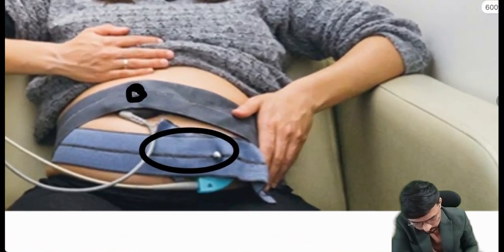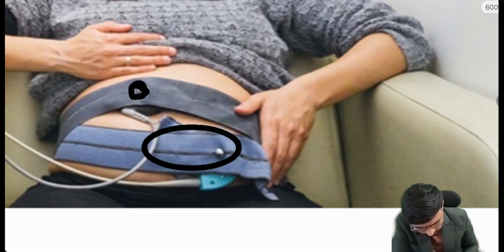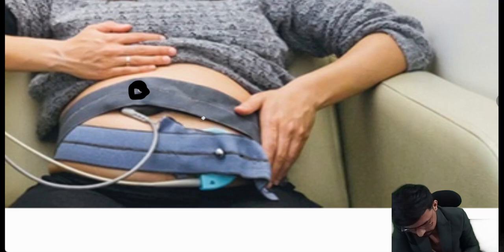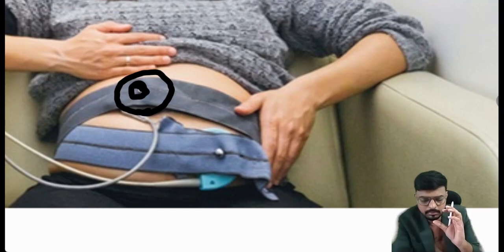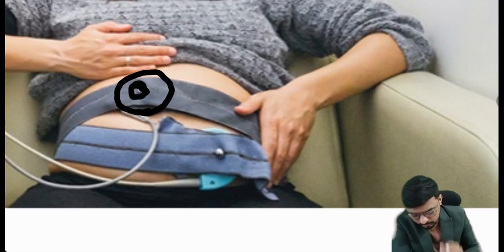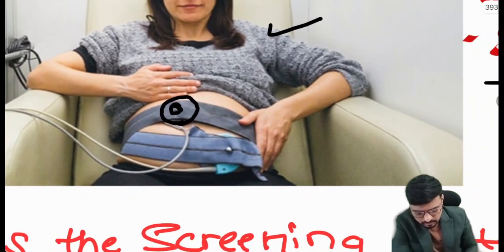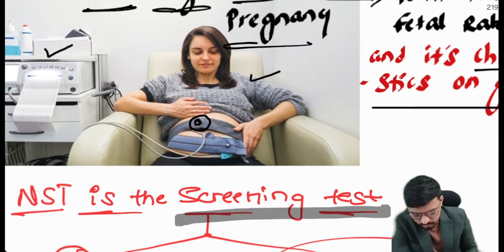Focus here. This particular pad-like thing that we have kept here is the transducer. On the transducer there is a button. On that we have applied a belt. That is the very important thing we have to monitor here.